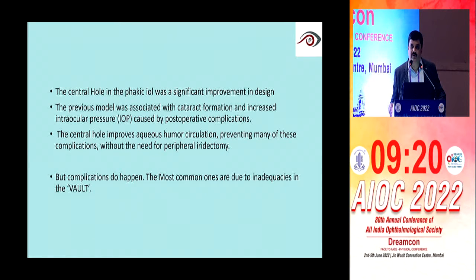But one important thing, the central hole in the phakic IOL was a significant improvement in the design. I started my phakic IOL practice almost 15 years back. At that time we did not have a central hole. The chances of increased intraocular pressure and cataract formation were much higher, but probably the greatest innovation goes to this central hole. But complications do happen with any surgery.